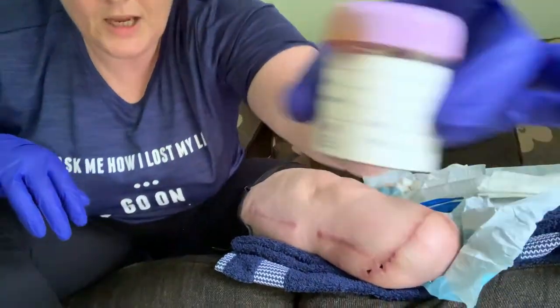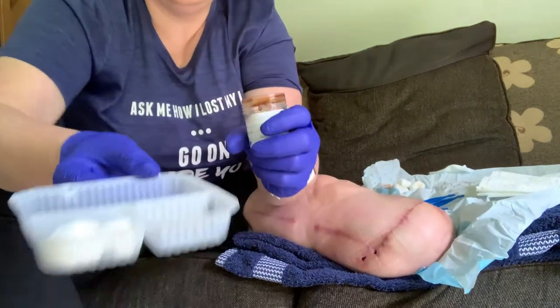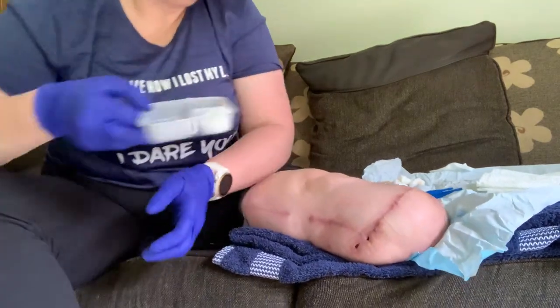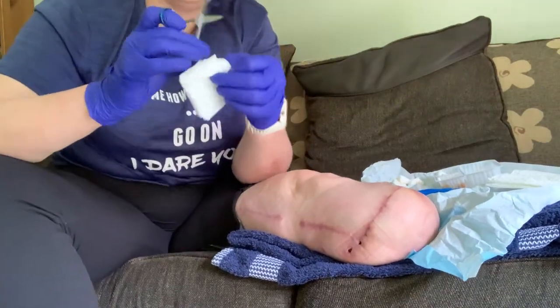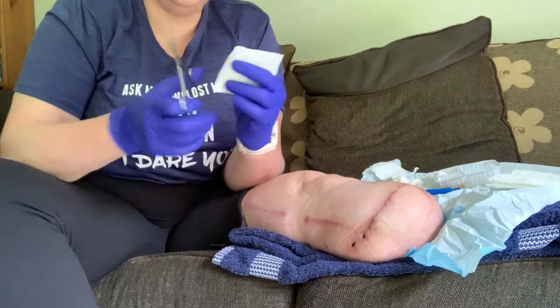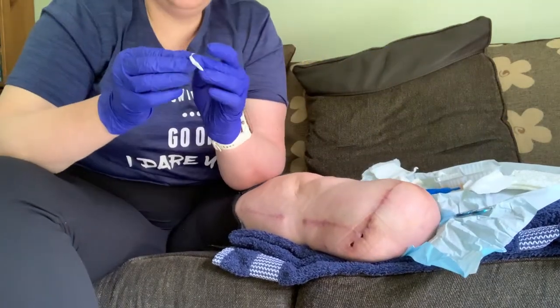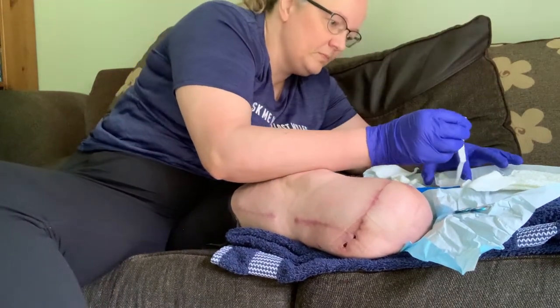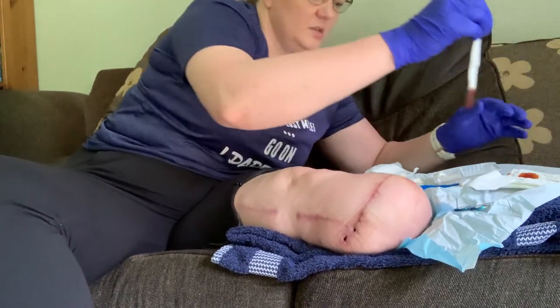Then we tip the iodine into the little container. I've only got a limited amount of this stuff and it goes into one of these little holes here. So there's the iodine. Then we get the scissors and we are going to cut the gauze in a certain direction. If it's stretchy, we don't cut that way — I think it's this way. So we need little strips like that. She told me to check by pulling. This gets dipped into the iodine like so, and then we swab it off with the towel, and then it goes in the hole.